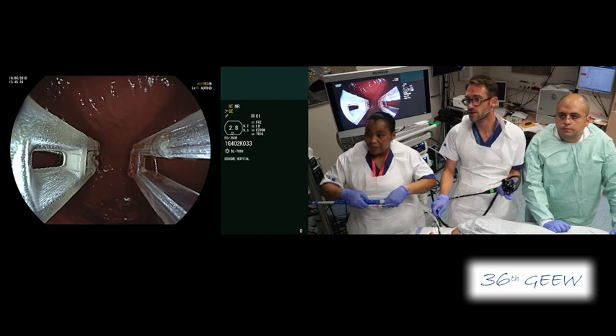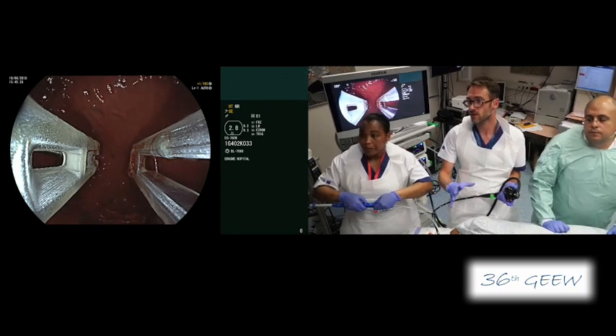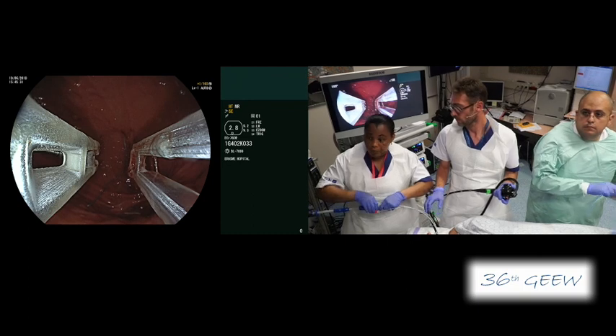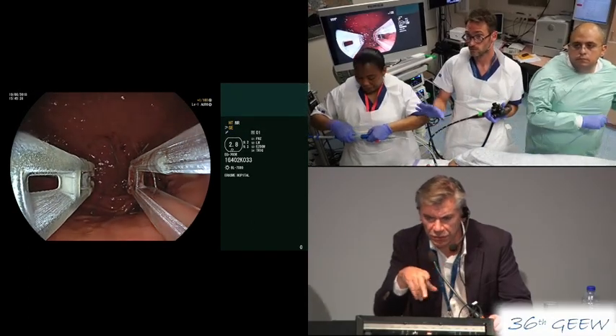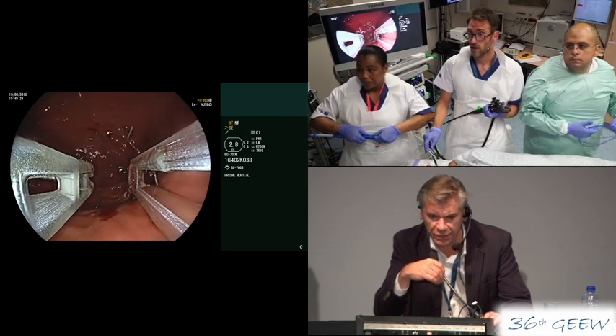Now we are releasing the wire, opening the arms of the Endomina. Thank you, Vincent. We are now close to the break and we have a short look at the ESD procedure before the break.